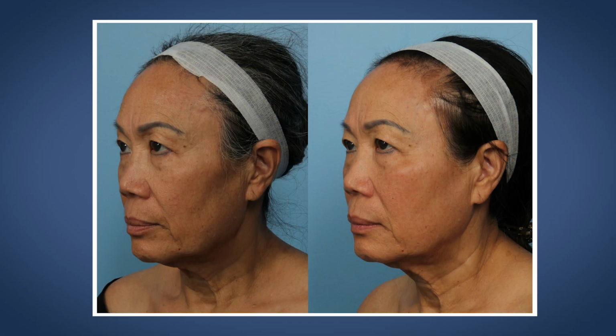Okay, so let's see before and after. She was a patient who was a little nervous, and she didn't want to have the downtime of the Halo, even though it's not particularly terrible. So we did Moxie on her, knowing that she wanted to get some improvement relatively quickly.